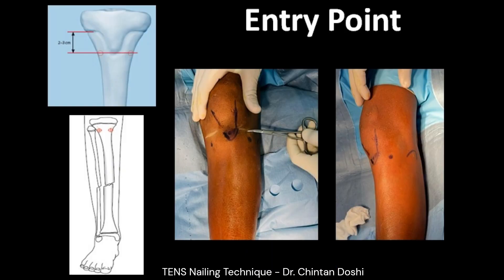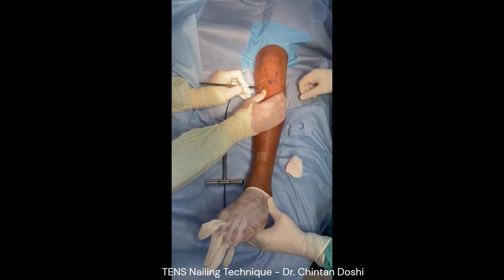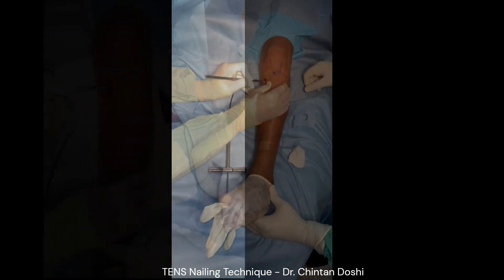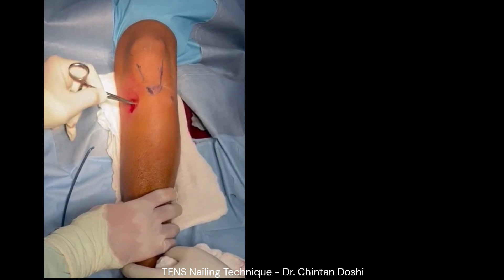Entry point markings are confirmed — 2 to 3 cm away from the physis and approximately 2 cm on either side of the tibial tuberosity. A skin incision is taken and soft tissue dissection is done to reach the bone and the bony entry point.